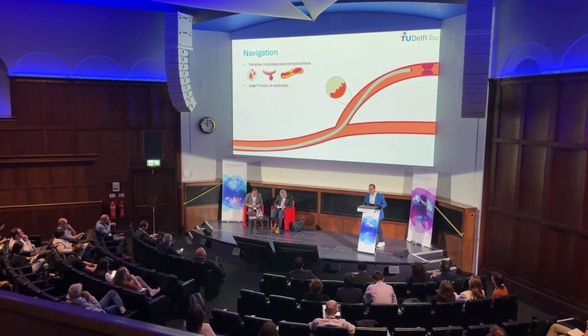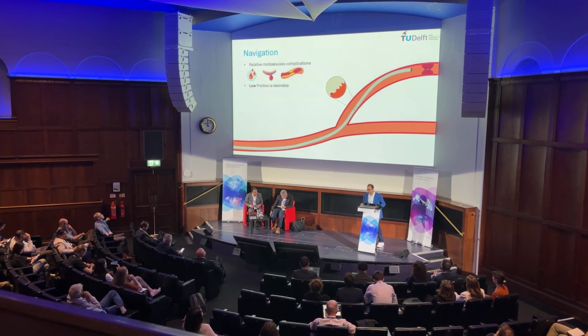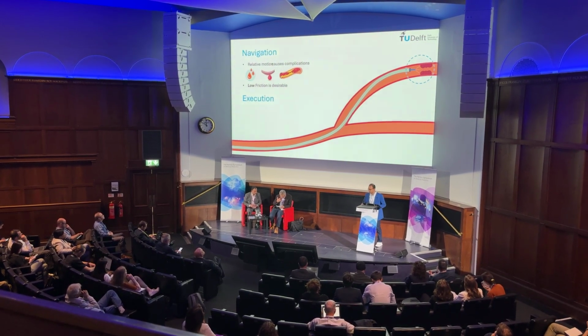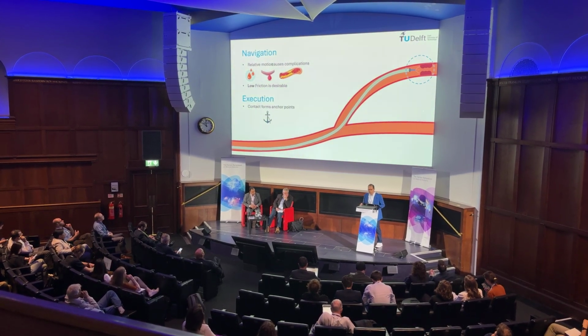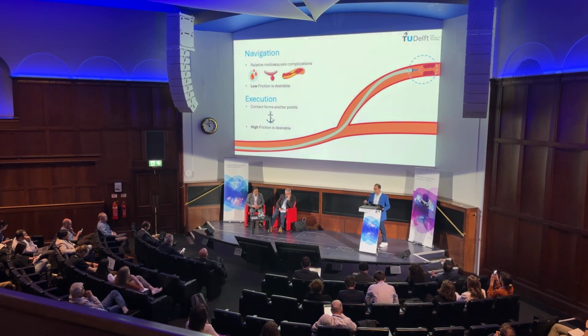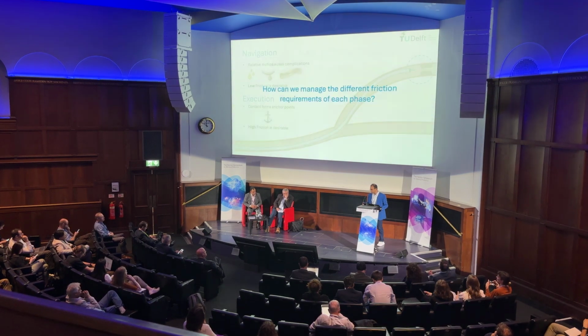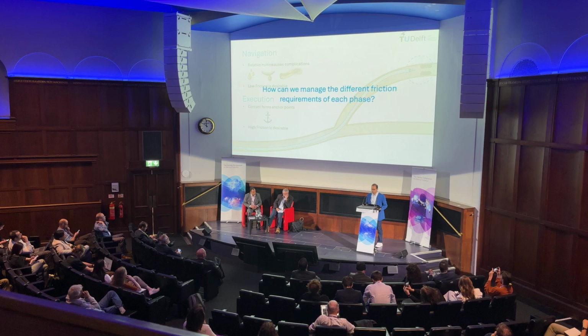So, in that sense, having low friction is desirable to reduce these complications and allow for seamless navigation of the catheter. However, once we start executing the actual task, like installing a stent or removing a blood clot, contact between catheter and blood vessel forms anchor points, which are necessary to maintain stability for the catheter. So in that sense, having high friction is desirable to maintain the catheter stability and allow for precise task performance. So the question is, how can we manage the different friction requirements for each phase?